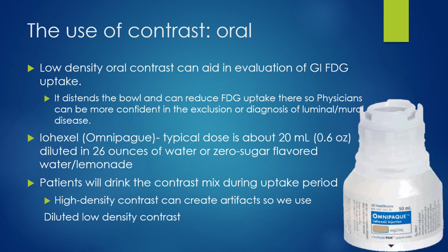Now, if you're using the low density iodine based oral contrast, patients will drink that contrast mix during the uptake period. So the whole workflow of it, you would get the patient from the waiting room, take their history, make sure they don't have any contraindications.